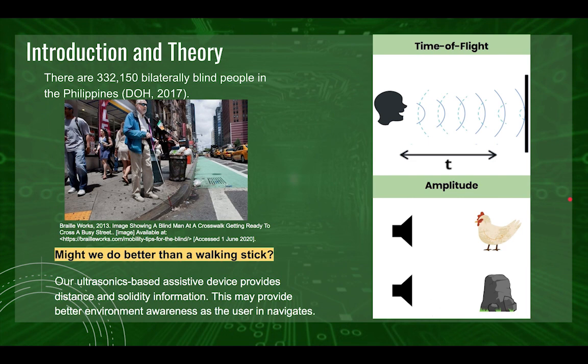The strength of reflection at a given distance can be a representation of the hardness of the material surface. Given the knowledge of how far a surface is, using traditional time-of-flight measurements, and being able to measure the strength of the echo, an estimate of the material's density can be determined.